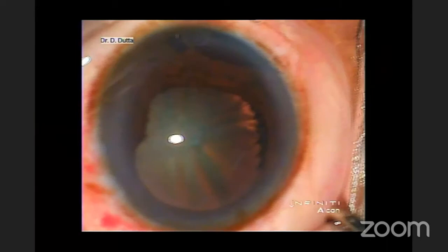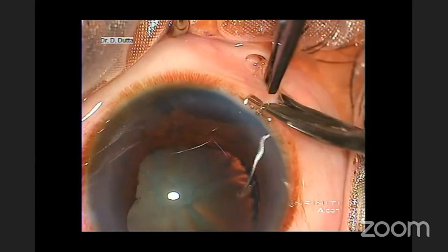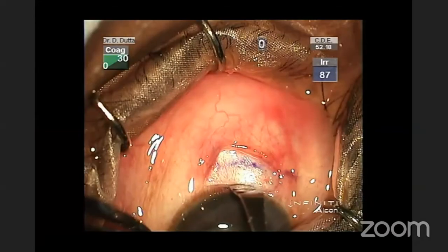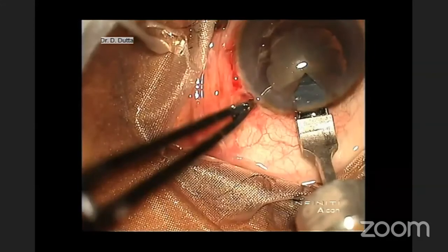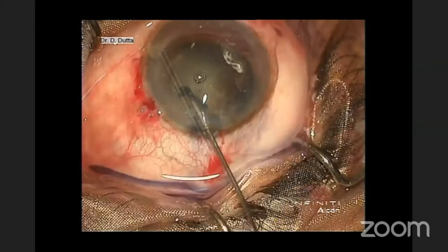Just removing your conjunctiva adjacent to the dialysis. Basically, this removal of conjunctiva was not much required. I'm making a Hoffman pocket here. First things first, triamcinolone is used to stain the prolapsed vitreous. I stain your anterior capsule with trypan blue.